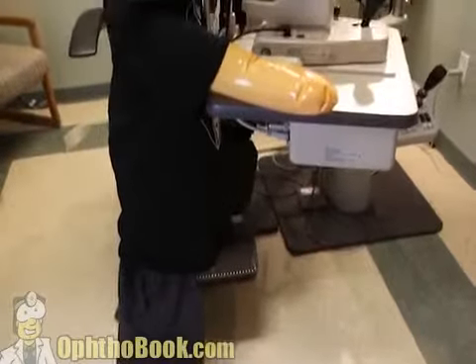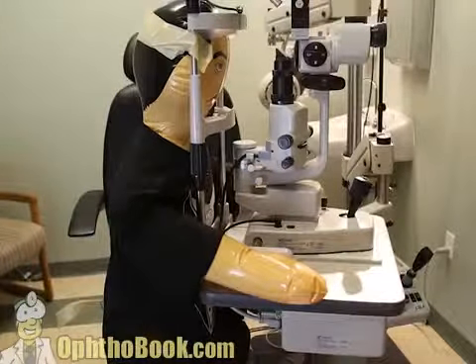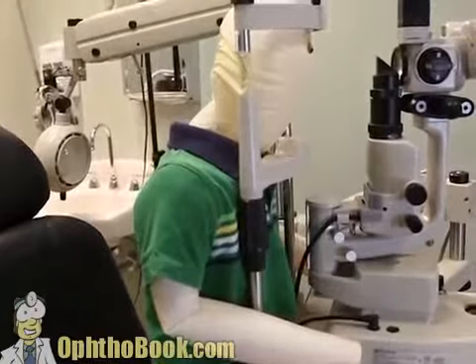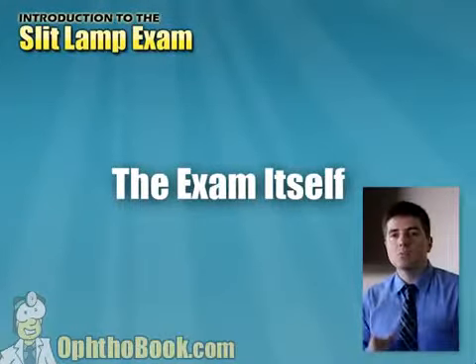Occasionally, maybe one time a year, I'll have a patient who actually does better standing up to get to the microscope. And of course with children, they're very limber, but they have short torsos, and so it's helpful to have them get on their knees and then get up to the microscope that way, and a lot of kids do great with this.